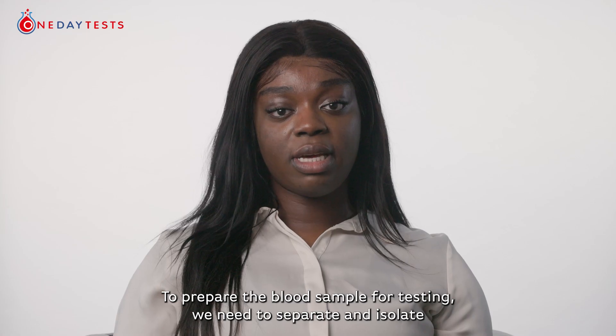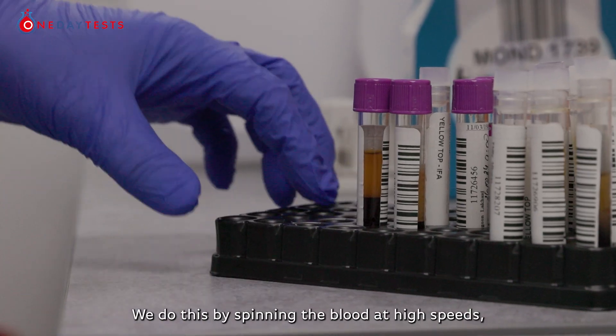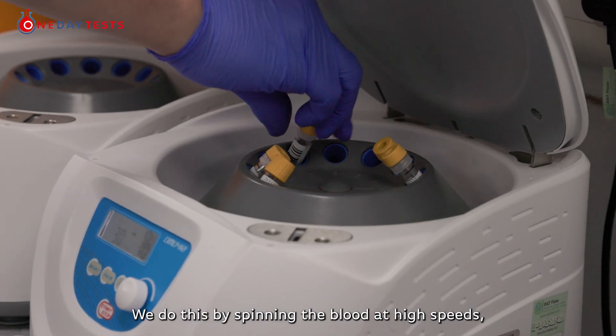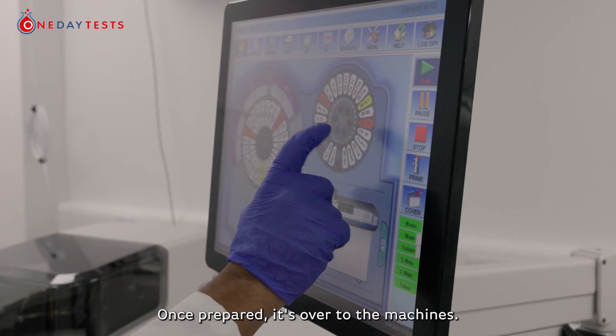To prepare the blood sample for testing, we need to separate and isolate specific components of the blood. We do this by spinning the blood at high speed, incubating, freezing, and aliquoting. Once prepared, it's over to the machines.